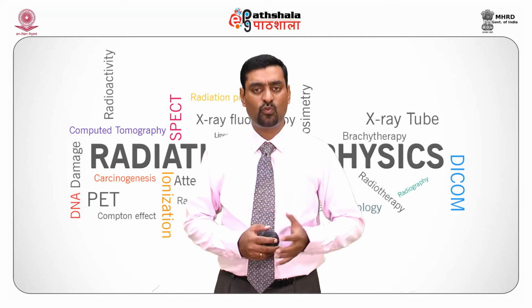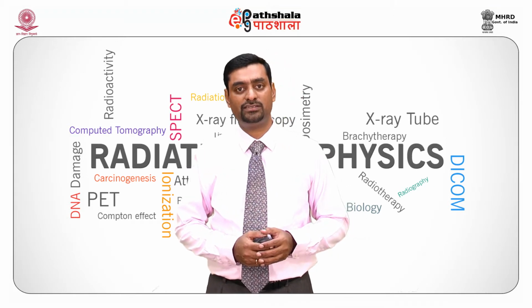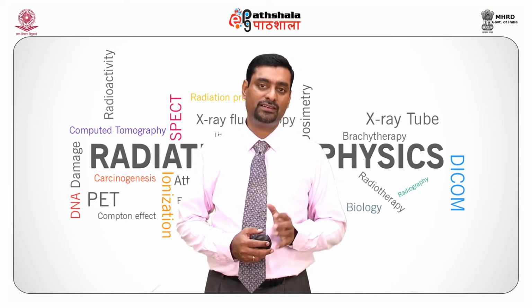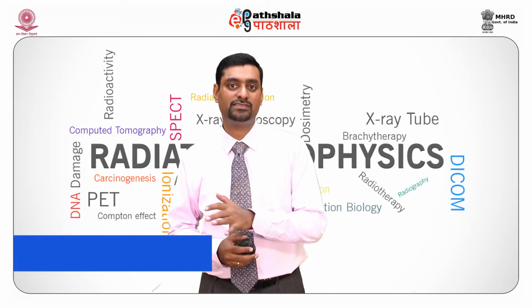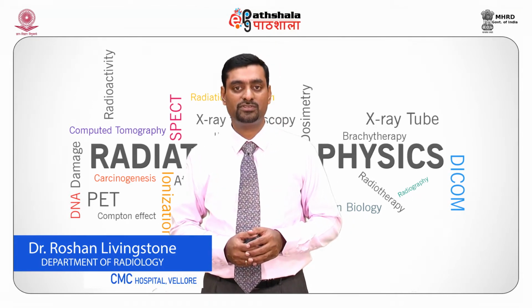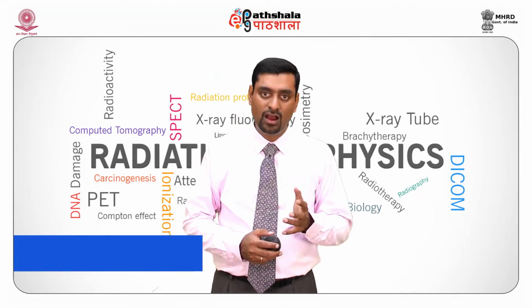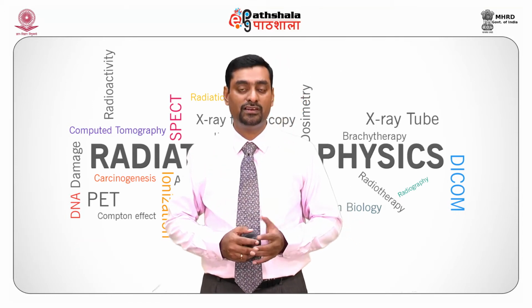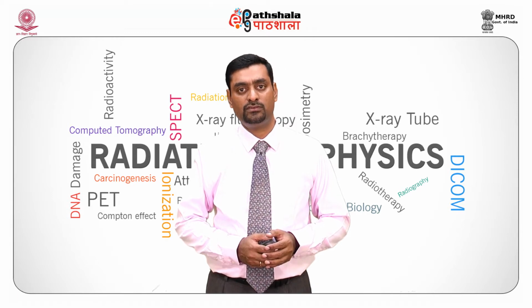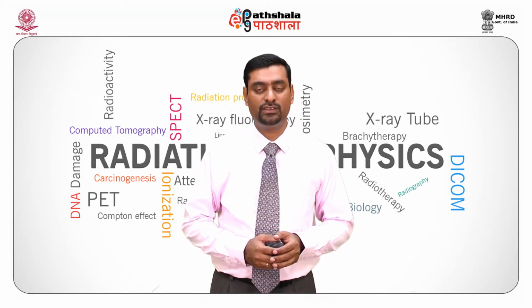So, this has been widely used for more than 100 years throughout the world. But over the years, we see this technique is being transited, and now computed radiography or digital imaging systems are in place. However, most rural areas in India still use film screen radiography. So, what is the most important thing we want to see?